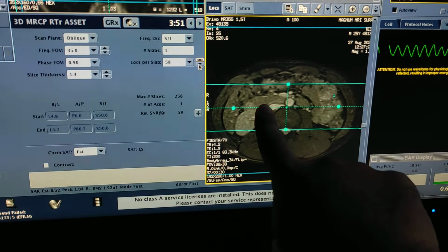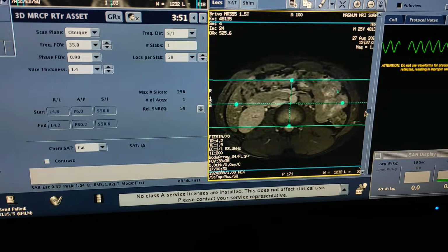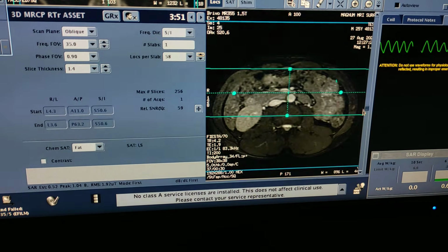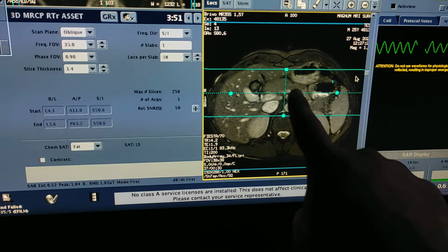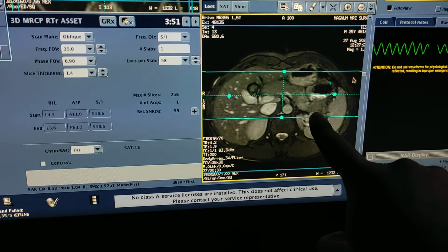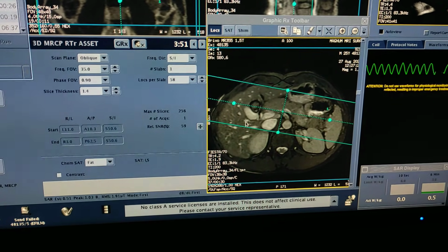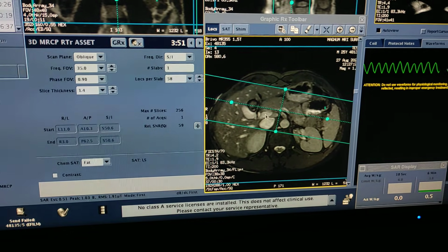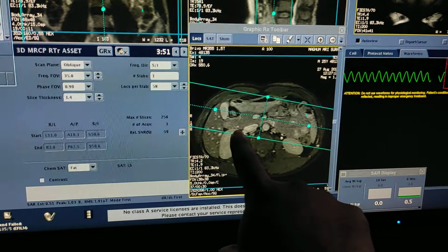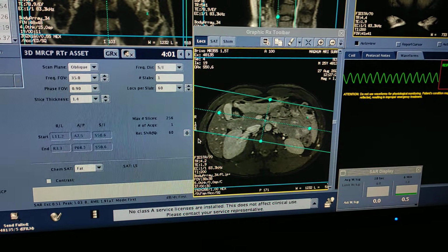CBD is draining over here in this bowel, so this much area you have to cover, including this gallbladder. Here is the gallbladder, and you have to angulate covering this tail of pancreas, because the pancreatic duct is ending over here. So you have to angulate this. This will cover gallbladder, CBD, pancreas as well as the pancreatic duct. Now you can check, this is CBD draining over here in this bowel.